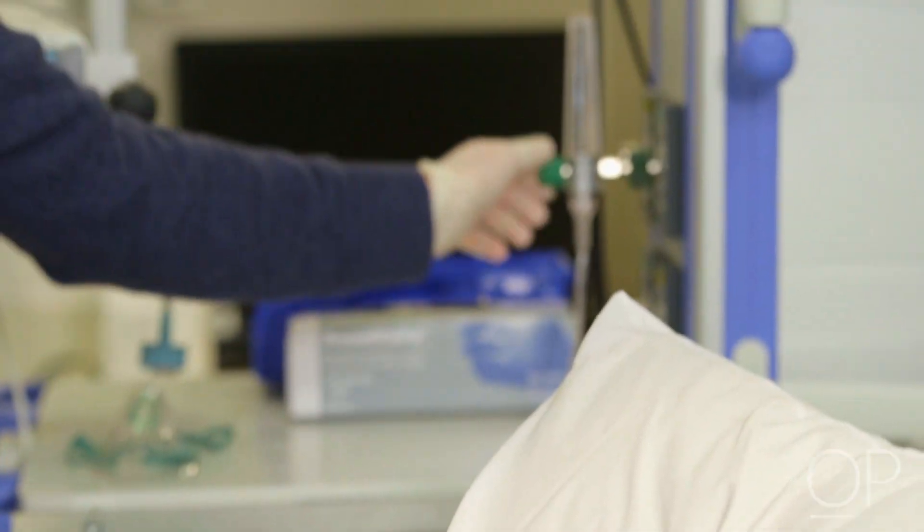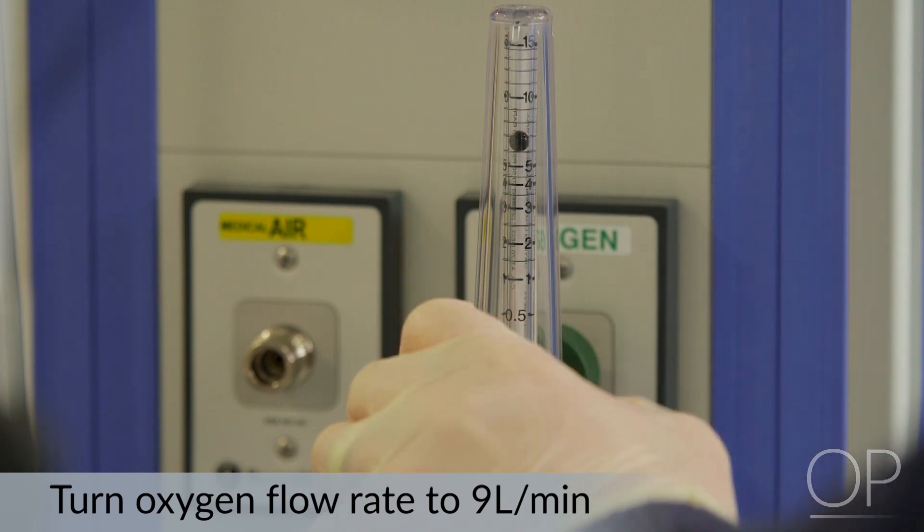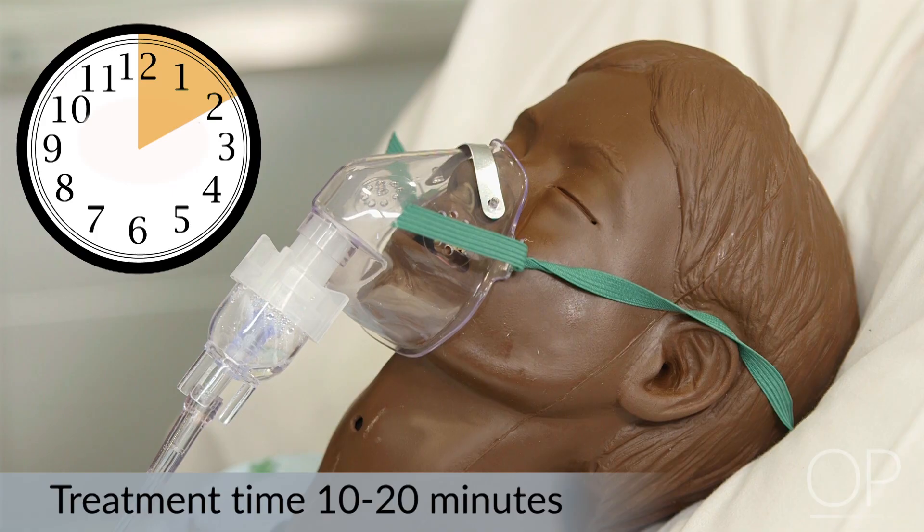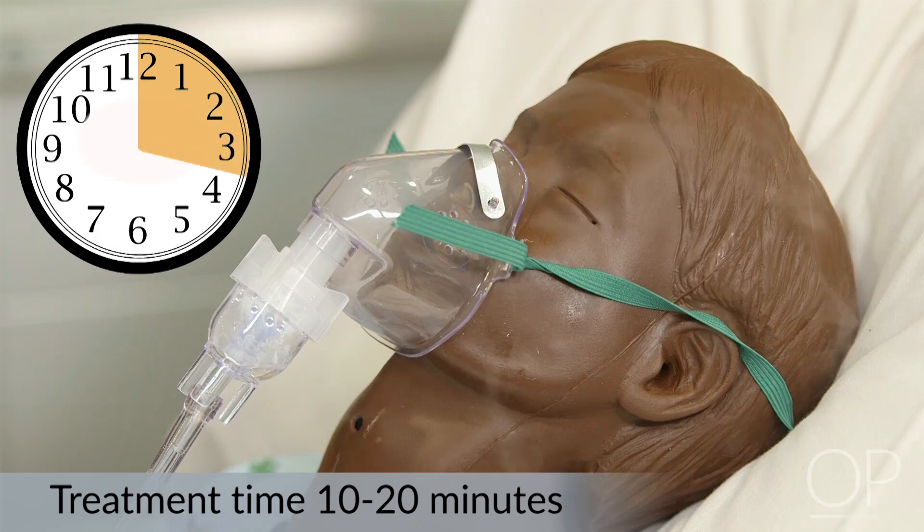I'm going to turn the oxygen flow rate onto 9 liters per minute as per recommendations by the manufacturer. This treatment should last anywhere from 10 to 20 minutes.